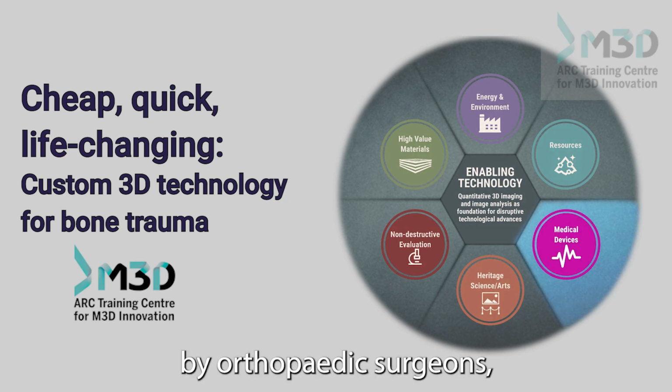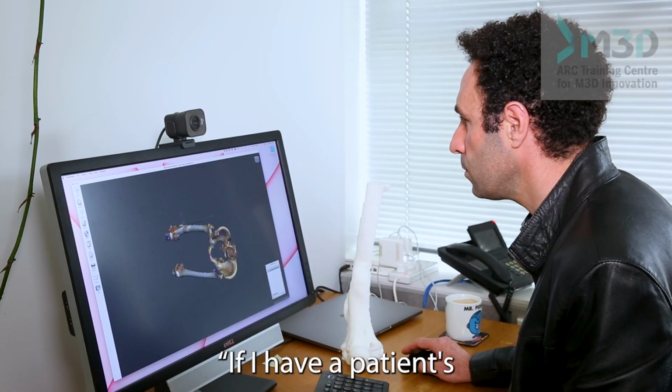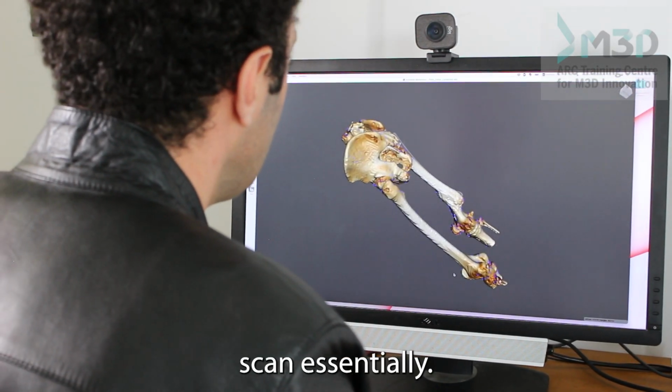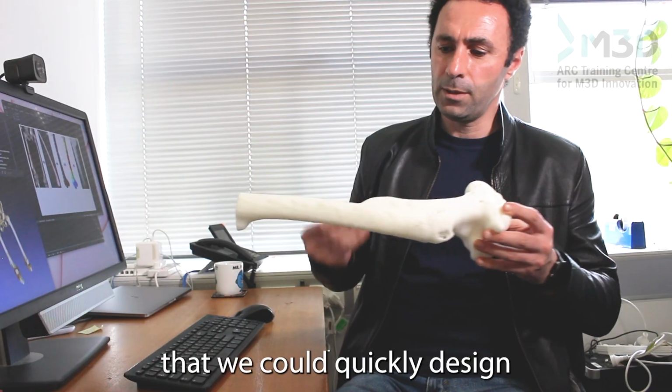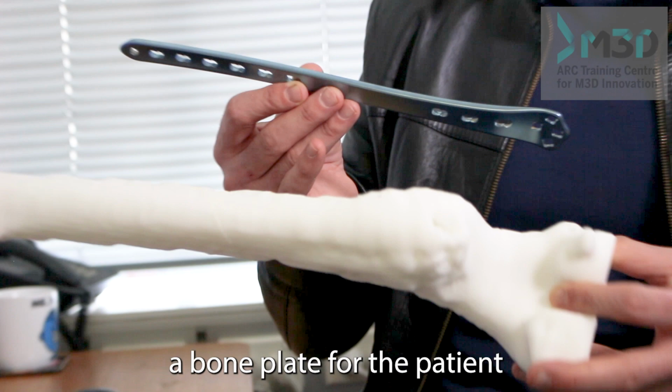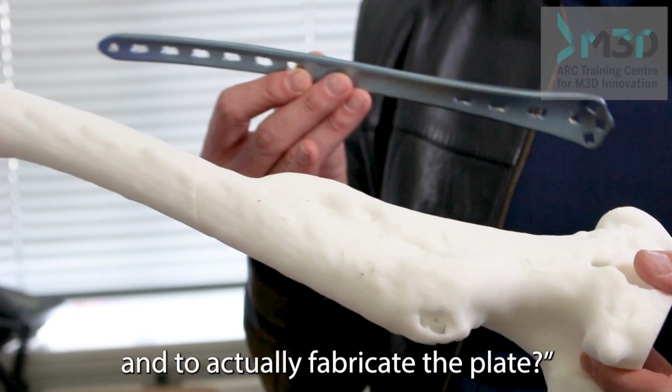We were approached by orthopedic surgeons, our partners in Canberra Hospital, and they came to us with a question. If I have a patient's digital anatomy, so the patient's CT scan essentially, is there a way that we could quickly design a bone plate for the patient and actually fabricate the plate?